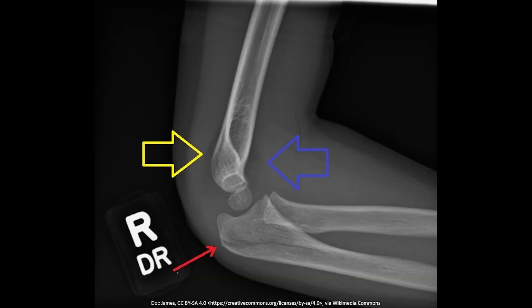In this lateral elbow x-ray of a patient who fell on their arm, we apply our three steps. We start by assessing the bones: checking the edges of the humerus for any fractures — none found — then the radius, and then the ulna, where we can identify an olecranon fracture.